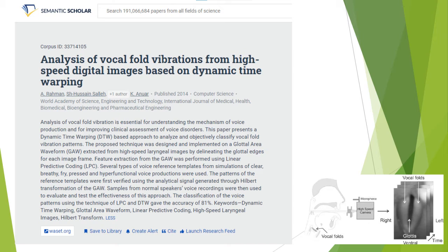Many papers in recent years discuss the possibility for quantification measurements for the vocal folds. Glottal area waveform is the focus in most cases, like in this overview. Trajectories is a possibility. There is another aspect of quantitative comparison of the acoustic sound to all of these quantitative methods that needs to be discussed.